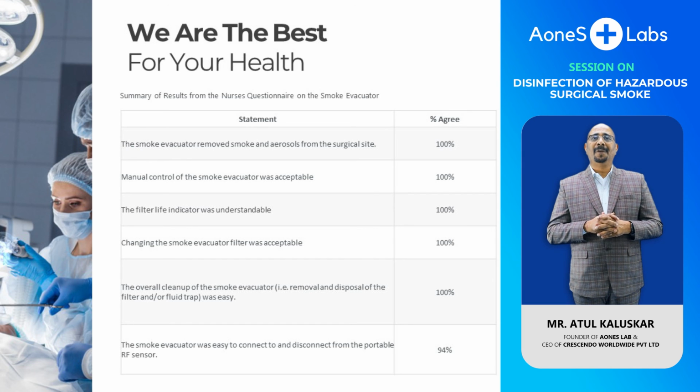But in open surgery, one has to develop a special accessory which will absorb or suck the smoke, pass it through itself, and then be connected to the surgical smoke evacuation device.